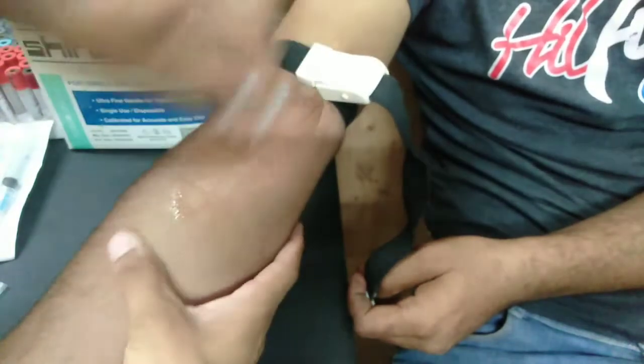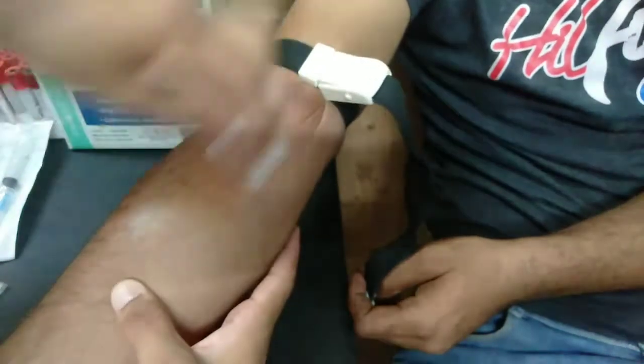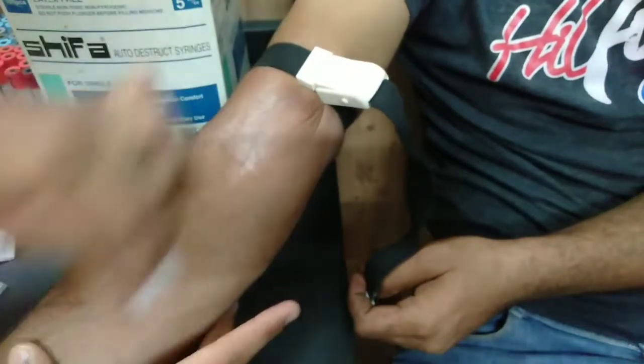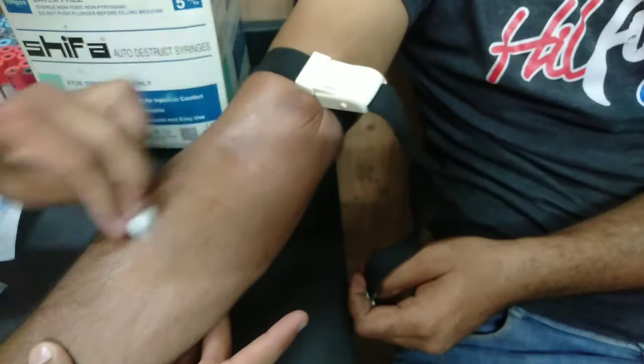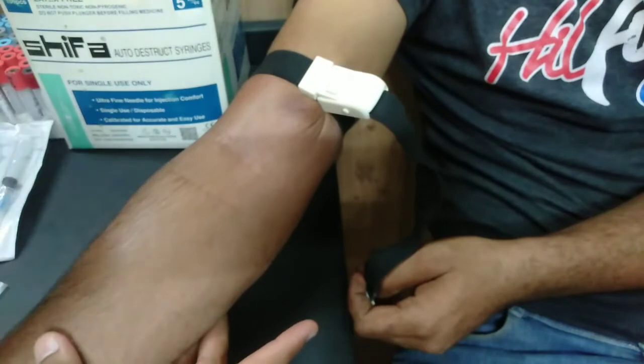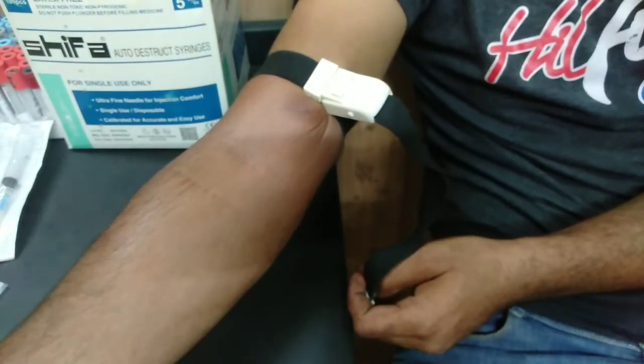Then we will clean the skin with antiseptic. After that, we will clean the area with alcohol. When you need to draw blood, you will clean your skin with alcohol. We will clean the area thoroughly, and after that we proceed.